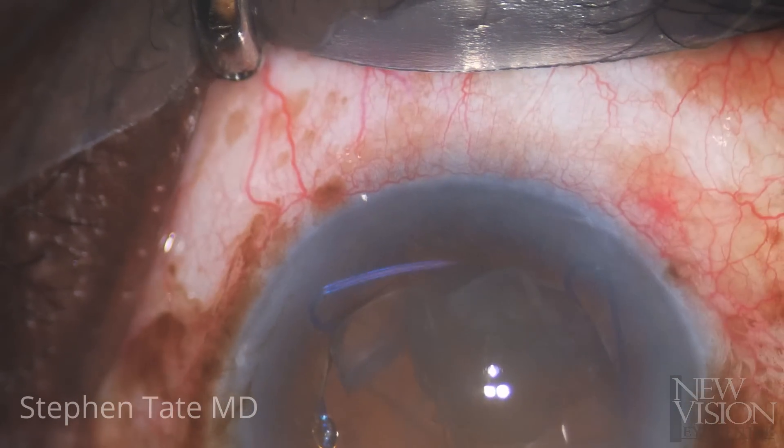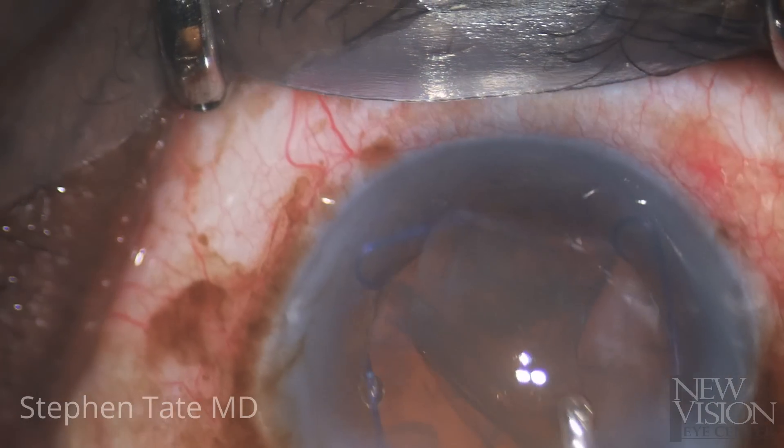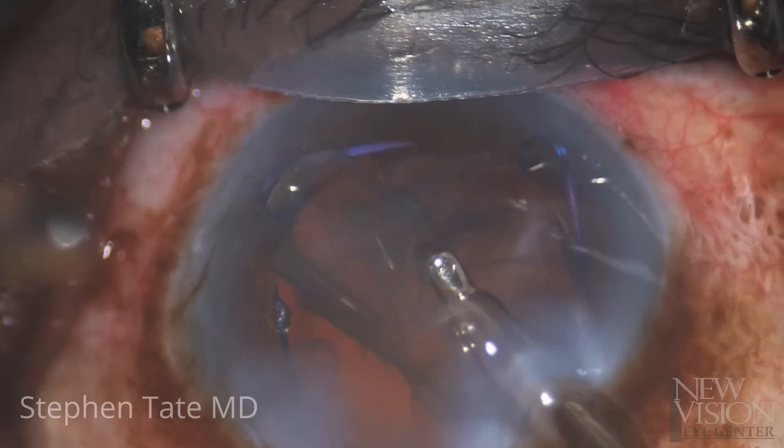The remaining cortex is stripped away, again being careful not to direct any force superiorly, perpendicular to the area of missing zonules.